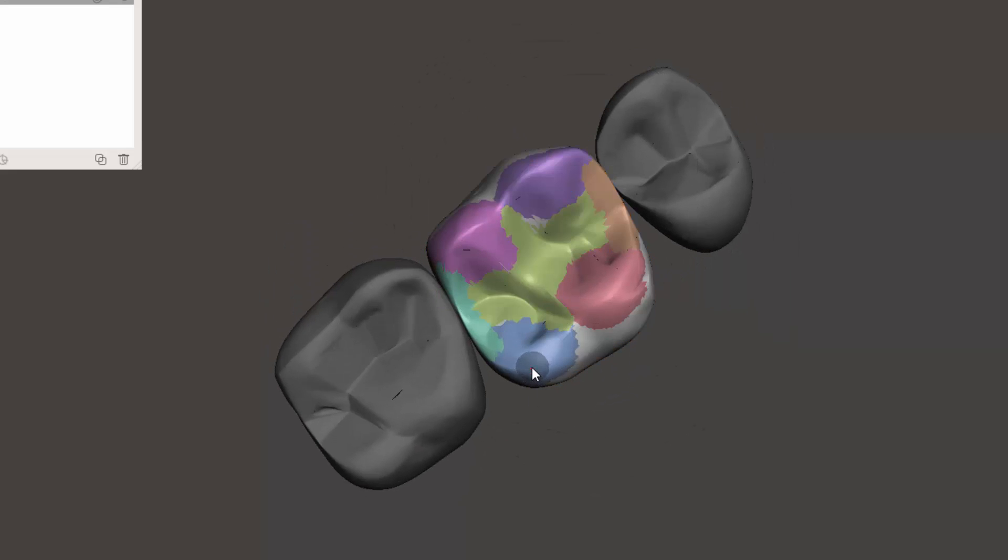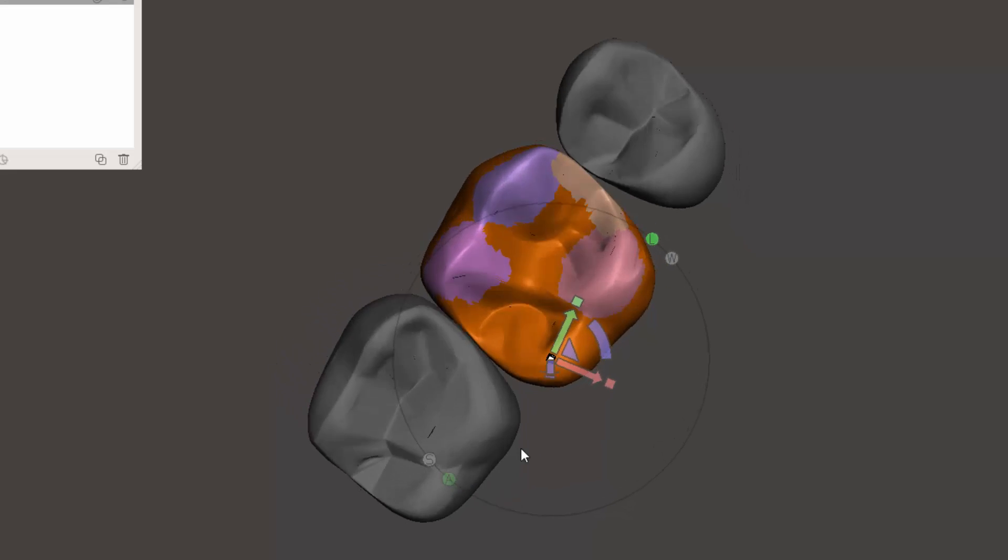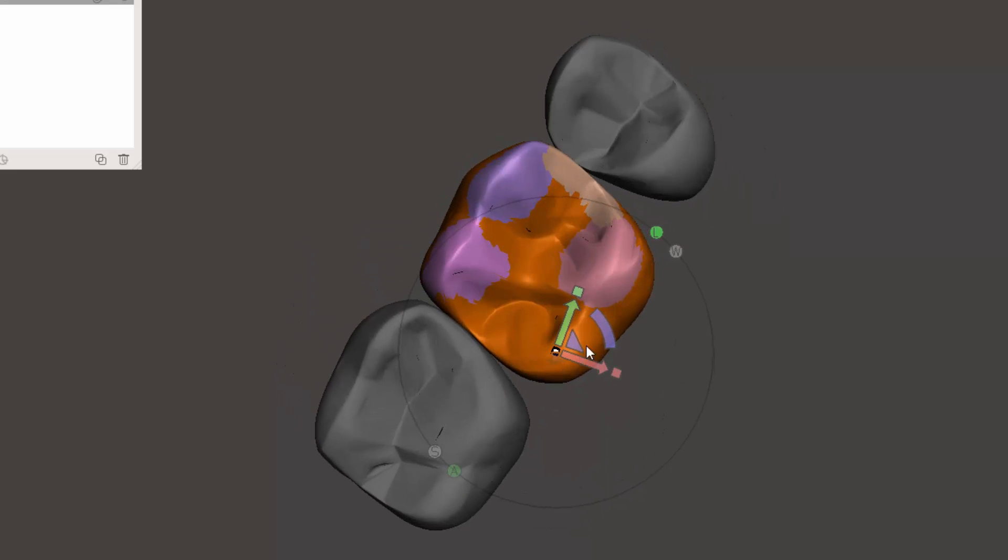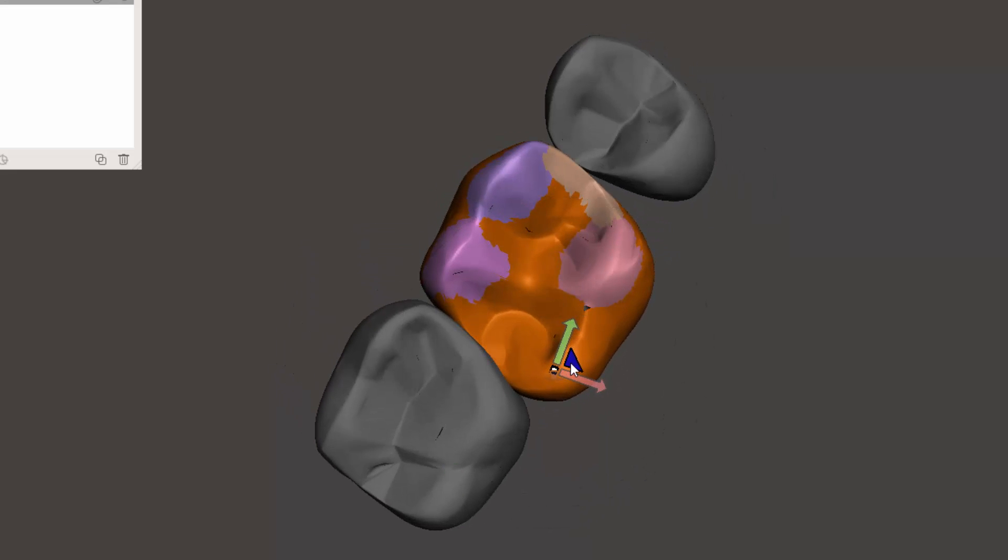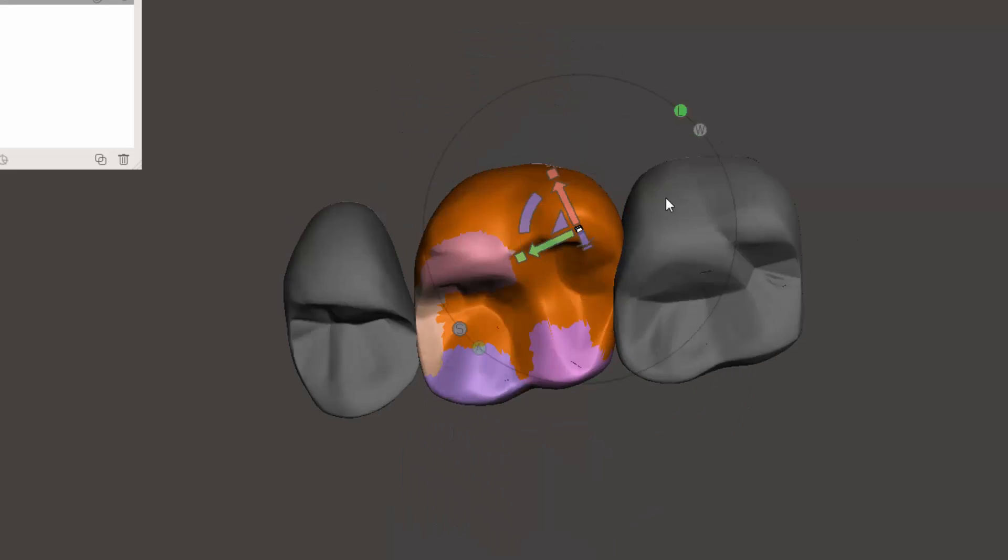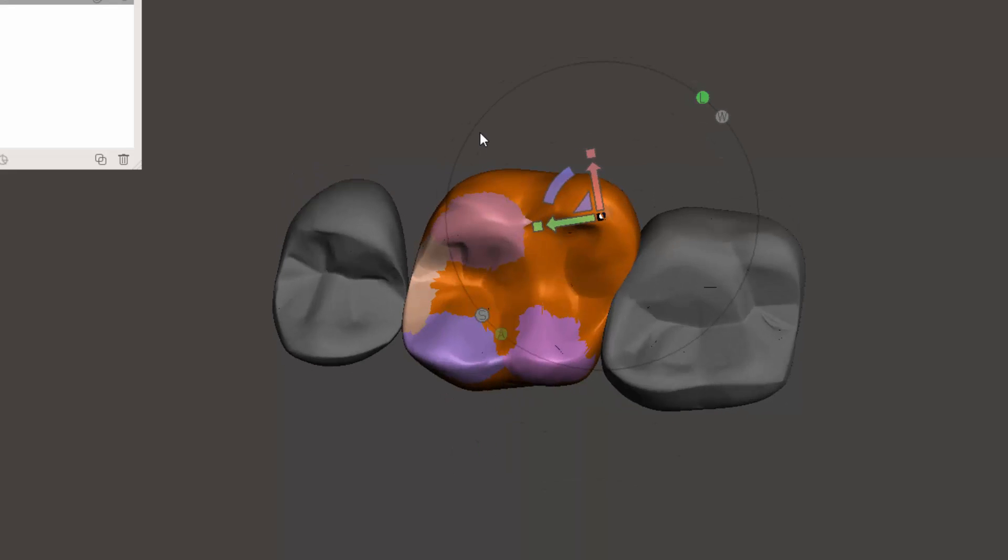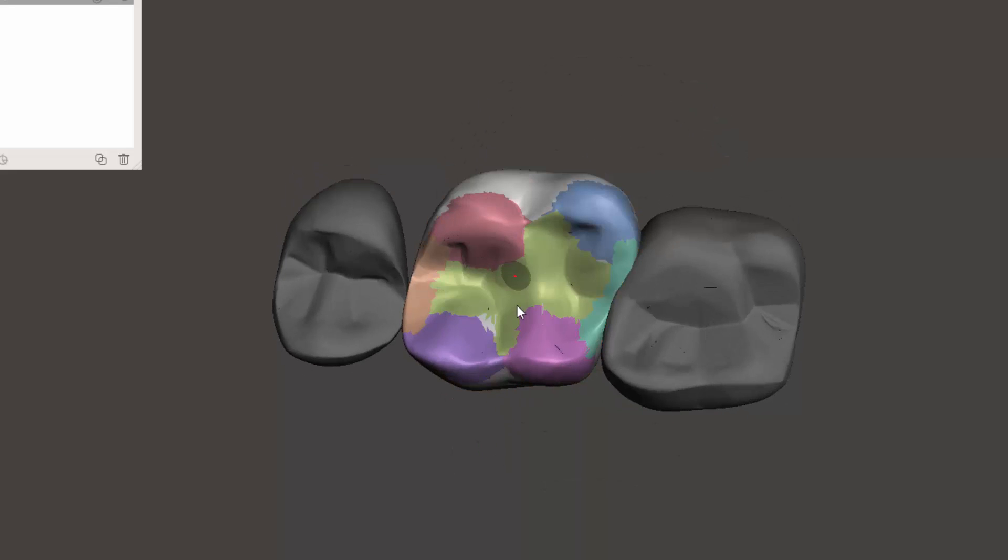Now I can come over here, select, select that, Shift+T. And I can move this cusp around a little to wherever I think it needs to be for this specific anatomy. Bring it down. That's good.